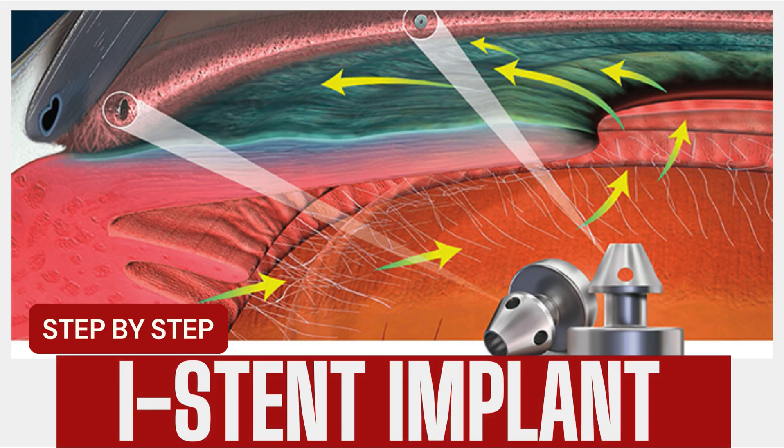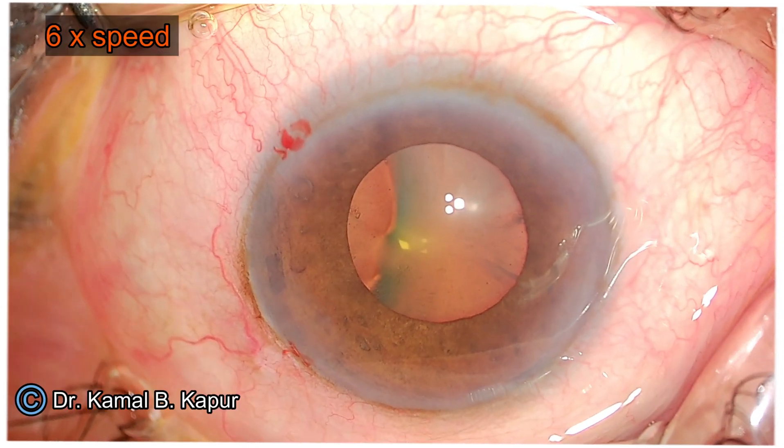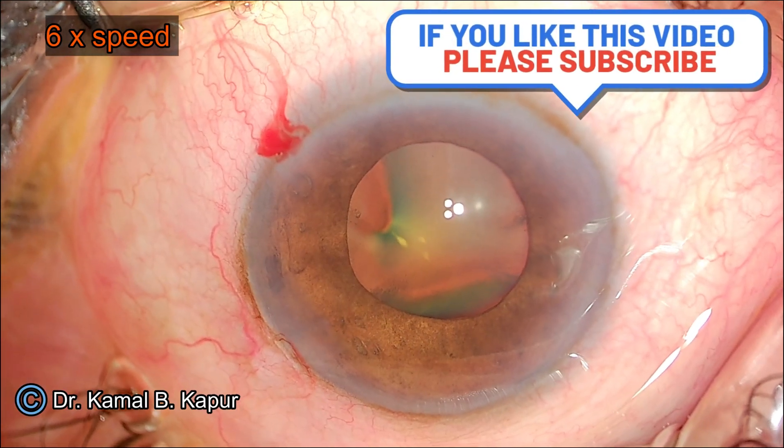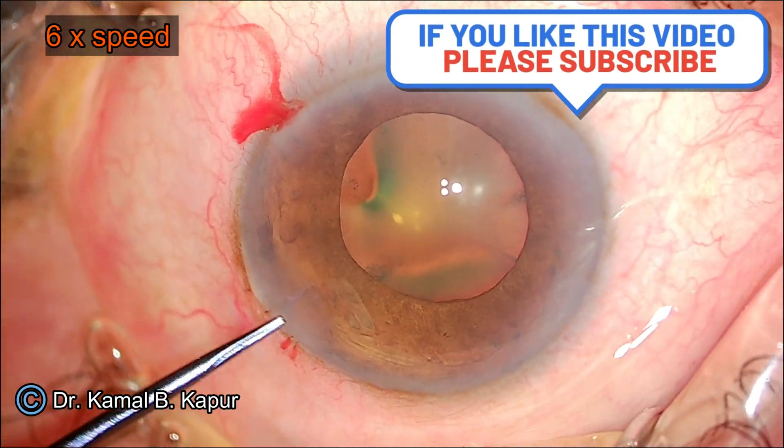This is a one-stop-shop video for eye stent implant. The eye stent is a small, microscopic stent manufactured by Glaukos.